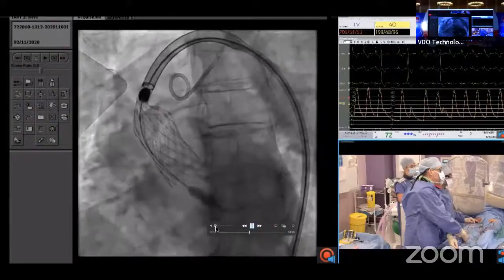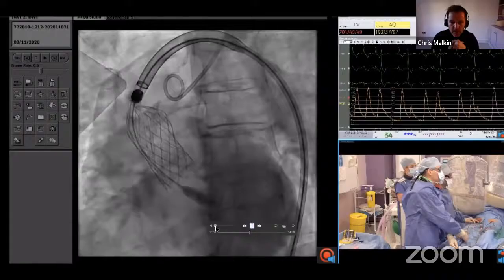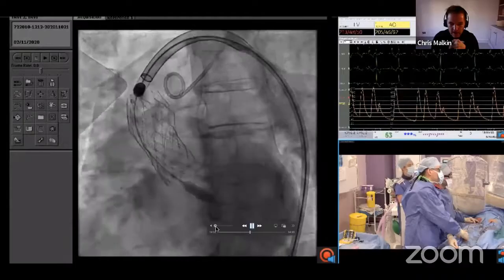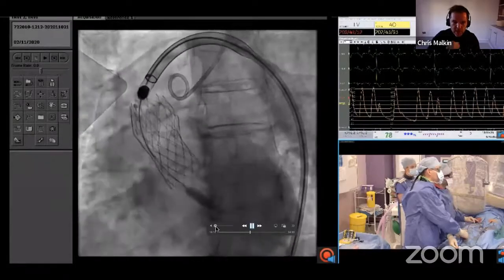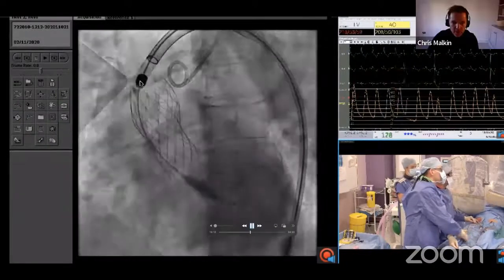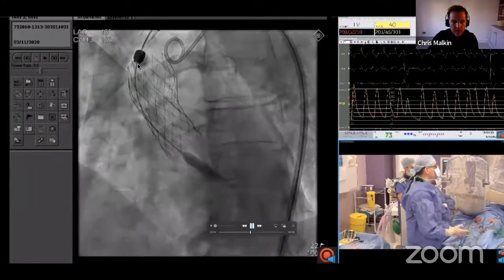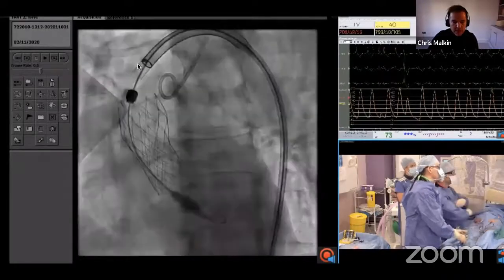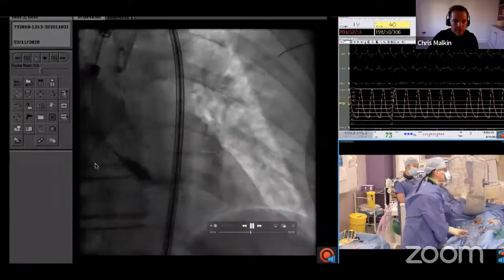And my colleague is, you can see the tiny movements he's doing with his right hand just to bring the delivery capsule off the paddles at the top of the valve, which is happening now. And I'm looking rigidly at the bottom of the valve to make sure that it is not moving. In fact, you will see that I had so much push on the system that actually I've managed to get the distal end of the capsule slightly engaged in the top of the cells. That's quite common. It's not a problem. You just need to be able to spot that. And we're just using the fluoroscopy to make sure that we're confident it's completely off.